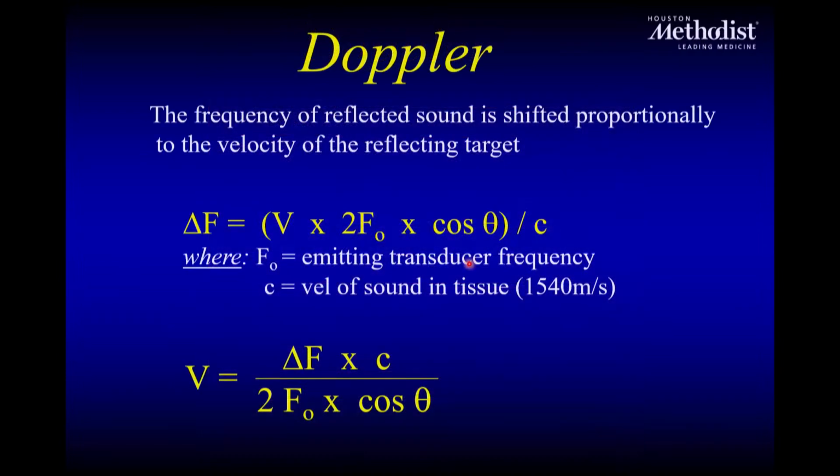So what is this Doppler equation? The Doppler equation is the frequency shift that we talked about, related to the actual velocity of that moving object multiplied by the original frequency that you send. Cosine theta is very important because if theta is 0, cosine theta is 1. Or if it is 180, it is -1. So basically, if I'm at 90 degrees, I get no frequency shift.